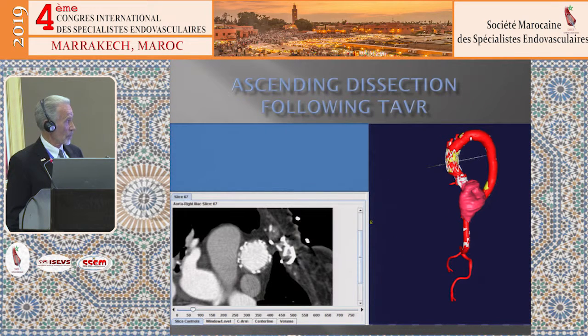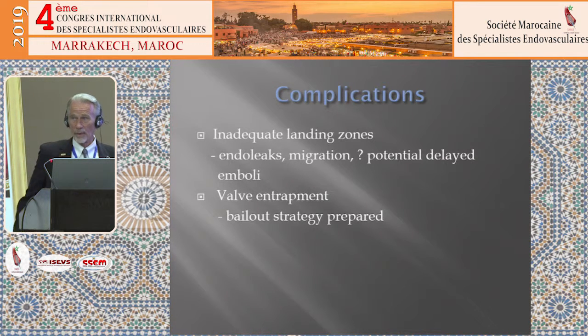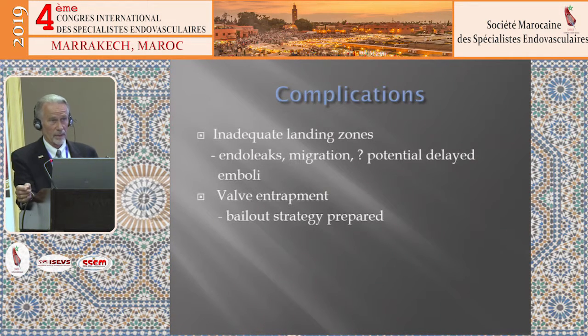There was disruption of the ascending aorta, and we were able to put a piece in there, and this is the follow-up image. So these are not all without complications, and I don't want to make it sound like things don't happen adversely, but we've been able to look at this, and these devices really don't migrate. If they're sized appropriately, they stay in place.